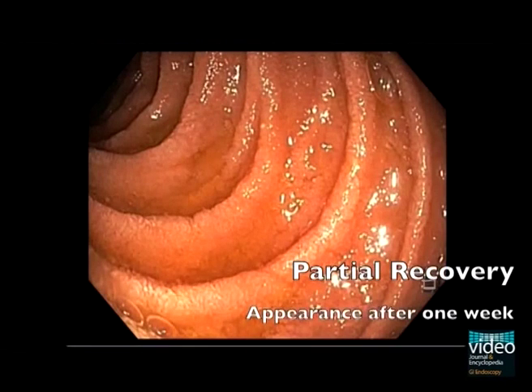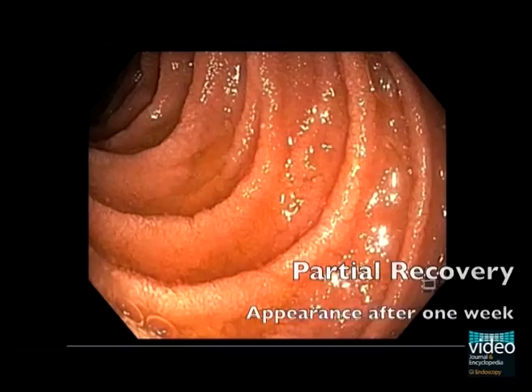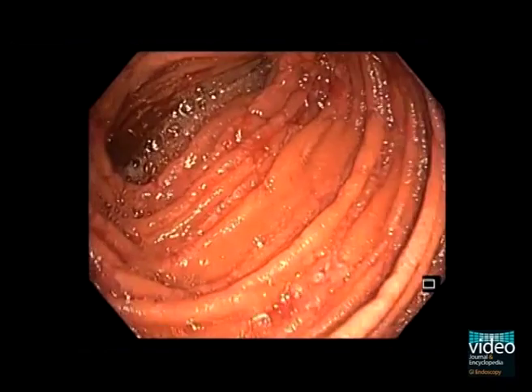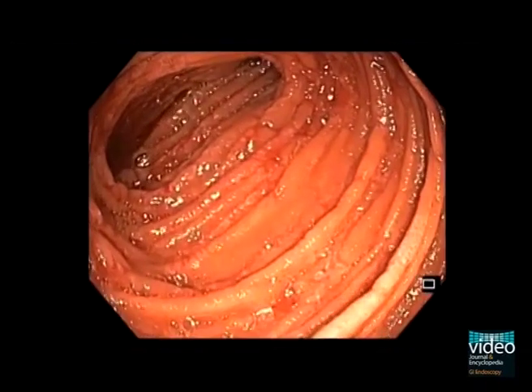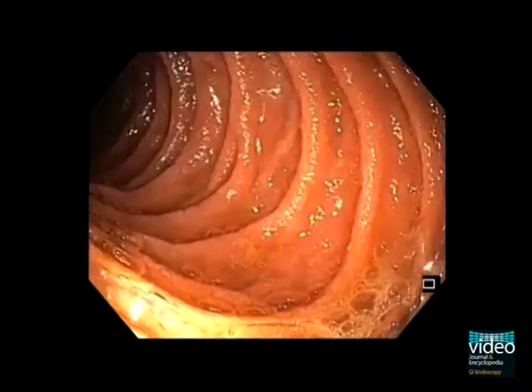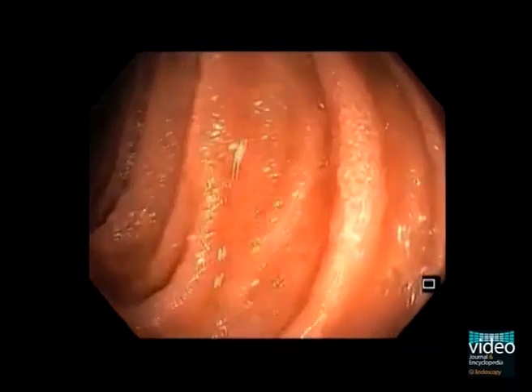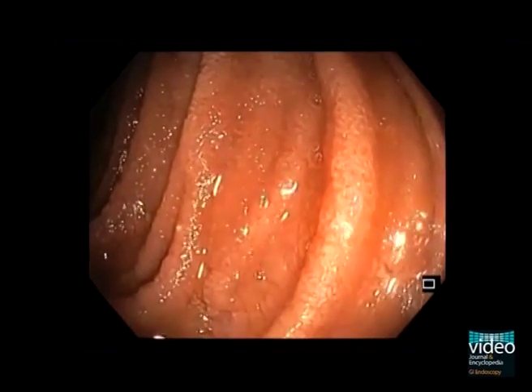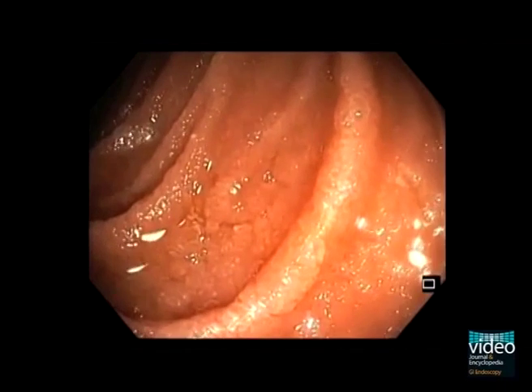After one week, the mucosa has partially recovered, the lumen is less distended and peristalsis is seen again. There are still areas with villus atrophy, fissures, mosaic pattern, and white villi surrounding the healing ulcers.